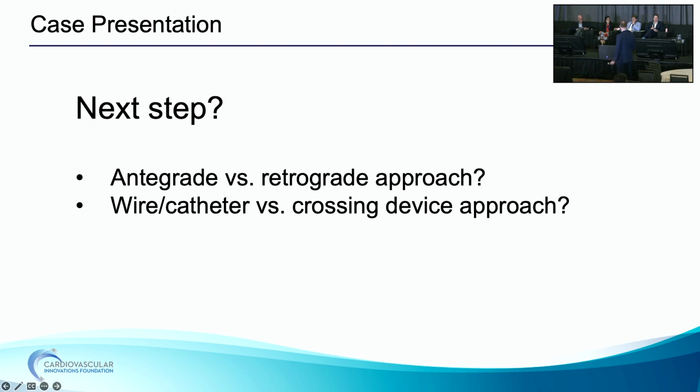I understand the classifications. I'm going at it from above. Call it whatever you want, class 1, 2, 3, 4. I'm going to try it from above. I'm going to try it at 014 initially, because I think we know now if we can try to stay intimal, that's the way to go. So I'm going to try that first.